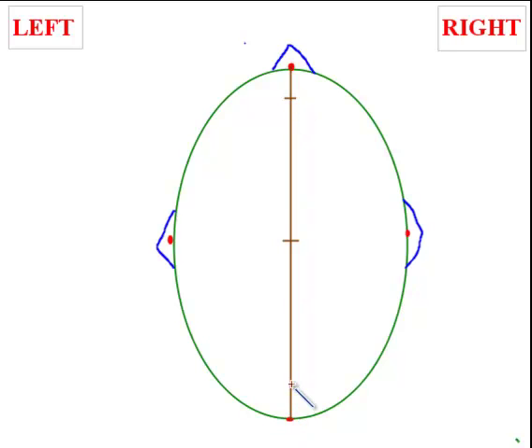And another 10% and you put a mark here. I am putting these approximate marks, so these are not exactly calculated.